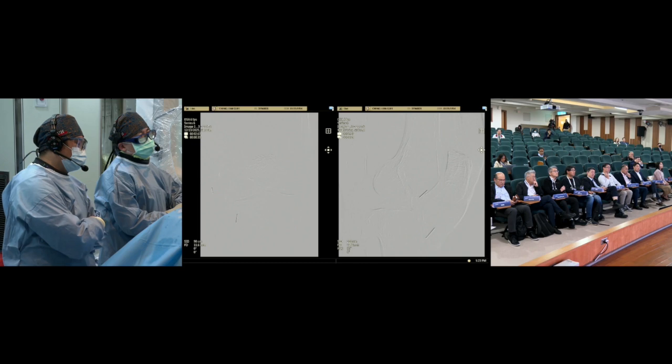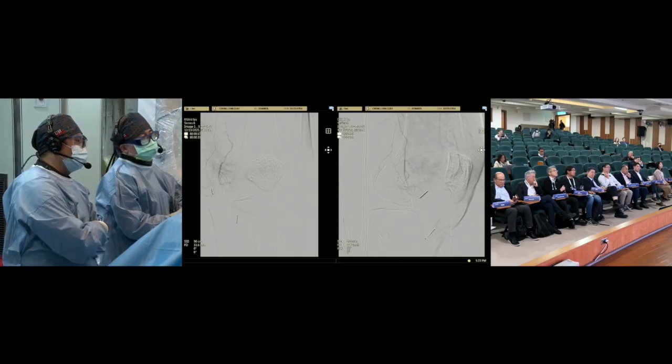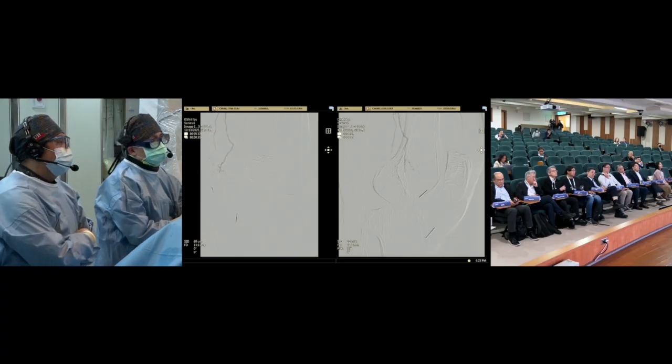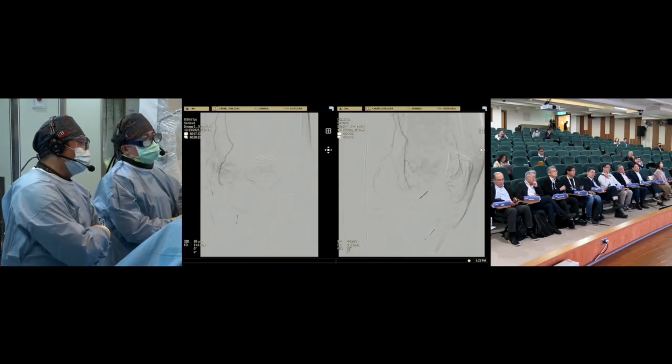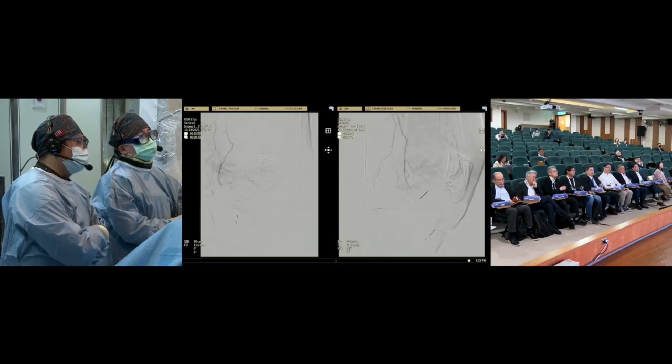But if you use a transient emboli agent, we will need to check every vessel and do every genicular artery for better results. So we finished the descending genicular artery, and then we will keep going to survey the others, including the inferior genicular artery, the lateral superior genicular artery, and the lateral inferior genicular artery.